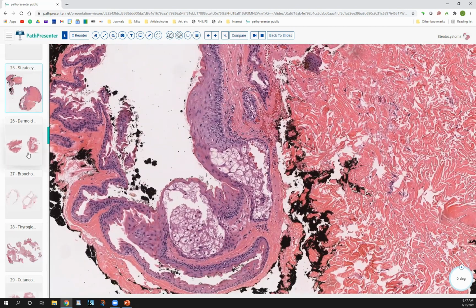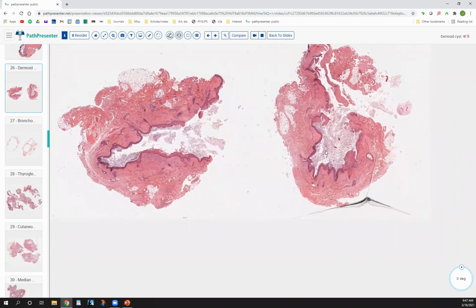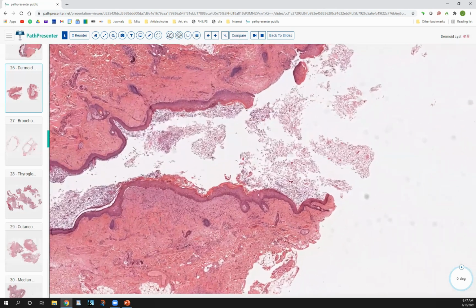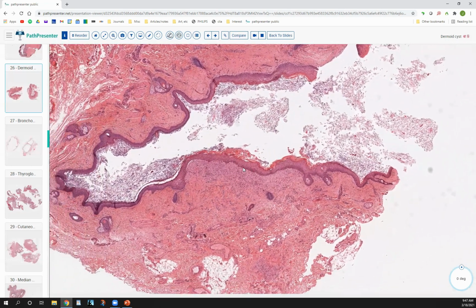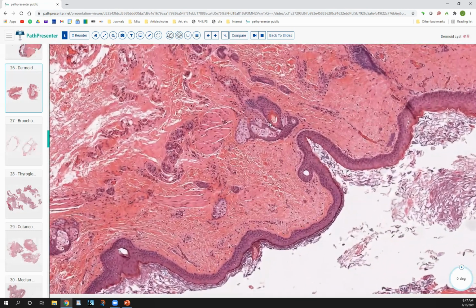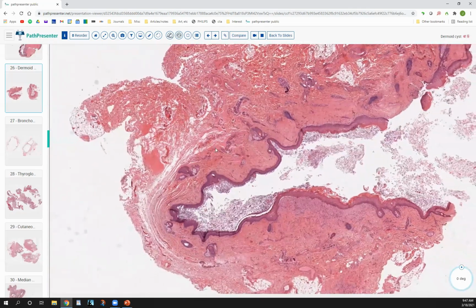Okay, so now we'll go on to the next case, another cyst. This cyst, I would think, is fairly deep, almost down into the fatty tissue over here. And again, at low power, the first thing I like to look at is the contents. And it looks to me like laminated keratin, kind of that shredded wheat appearance. So I would start thinking of epidermoid cyst. But then you look around a little closer, and similar in appearance to steatocystoma, we have these sebaceous glands, but they're also associated with follicles right here. So these are like little mini follicular sebaceous units that are attached to the cyst wall.